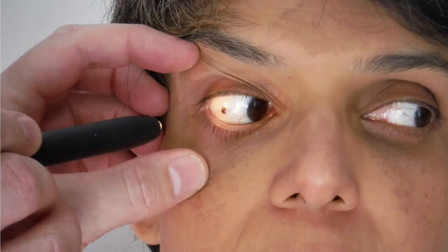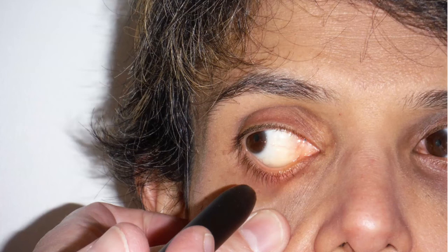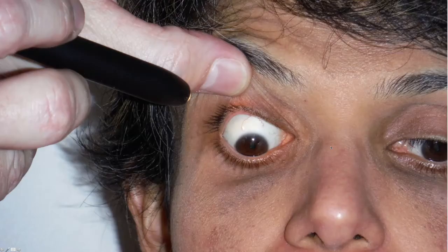We then get the patient to look in one direction and, apart from a very benign conjunctival nevus, this patient's lateral conjunctiva is completely healthy, as is her medial conjunctiva. We can then get the patient to look down and, by gently lifting up the upper lid, we can see most of the superior conjunctiva.